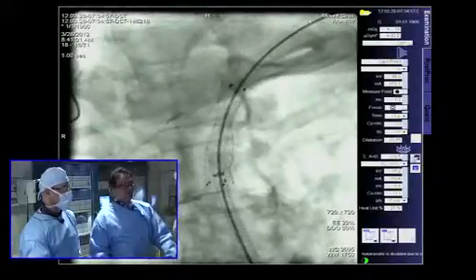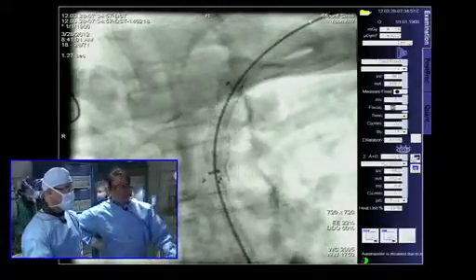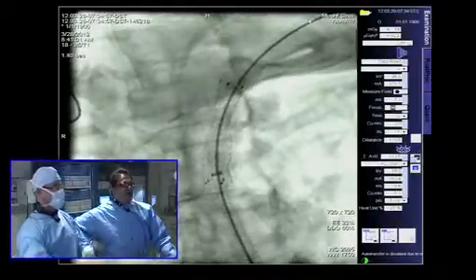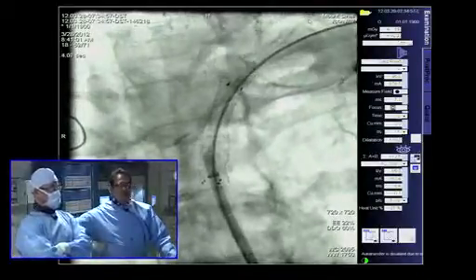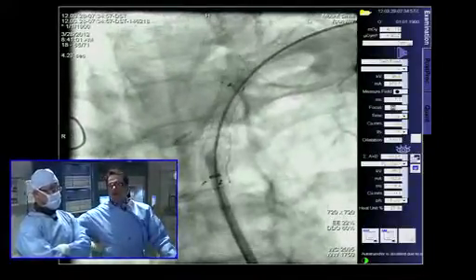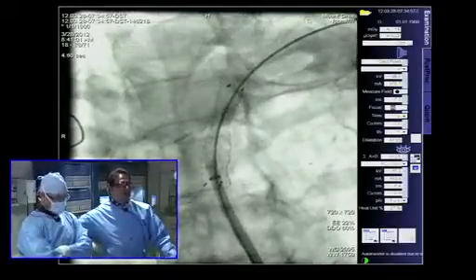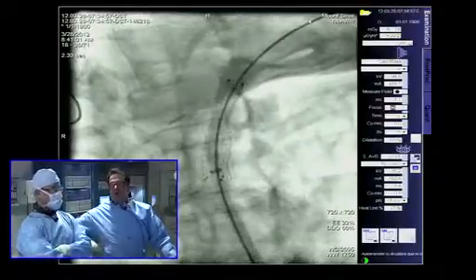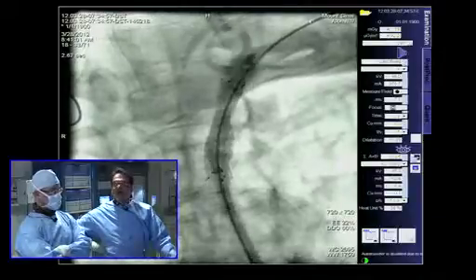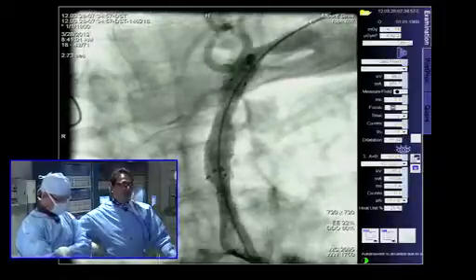In our experience, what we feel is that the radial strength of the atrium stent is not going to be as good as these other stents that we have. Number two, covered stents, when you're trying to do precise intervention, I know you can be precise because it's a balloon expandable stent, but God forbid you do miss, you're going to cover the ostium of the vertebral or the LIMA. Number three, as far as the rupture is concerned, clearly, God forbid you do rupture, but as we demonstrated in this really, really calcified lesion in the subclavian, it probably can be done safely without any issues of perforation.